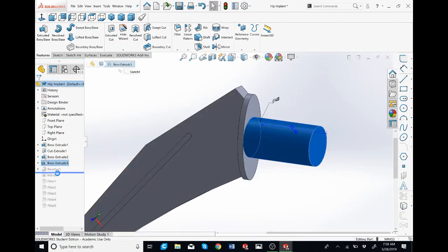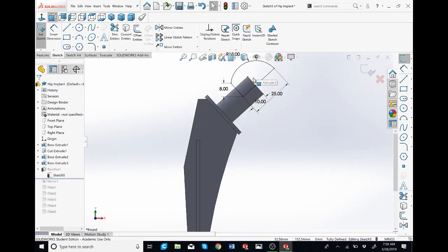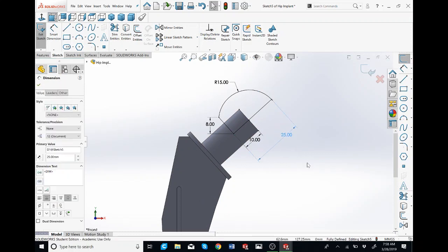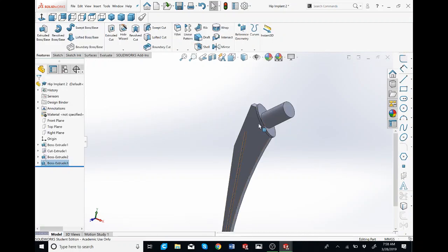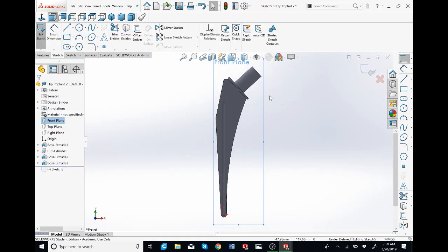I'm going to go down here to the revolve. Go here, edit sketch. I have 4 dimensions here. So I have a 10, 25, 15, 8. So for this, I right click on the front plane, hit sketch.